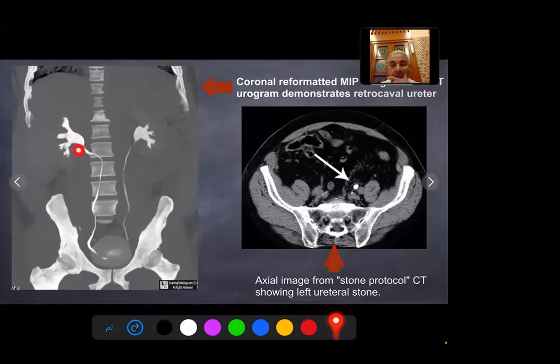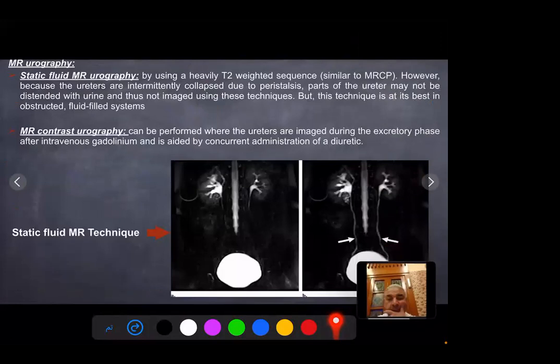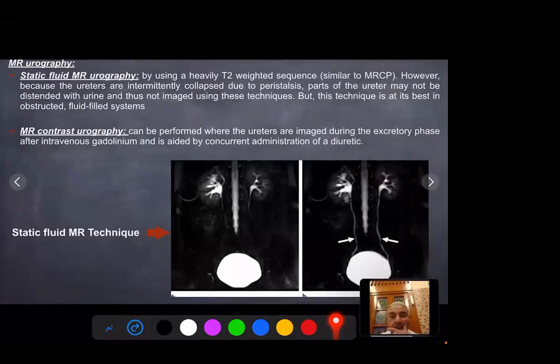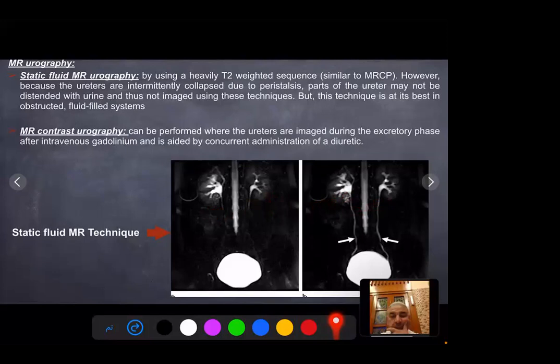Retrocaval ureter is a rare congenital anomaly. Static fluid MR urography uses heavily T2-weighted sequences similar to MRCP; however, because the ureters are intermittently collapsed due to peristalsis, part of the ureter may not be distended with urine and thus not imaged using this technique, though it is very useful in obstructed fluid-filled systems. MR contrast urography can be performed when the ureters are opacified during the secretory phase after intravenous gadolinium, and is aided by concurrent administration of a diuretic.